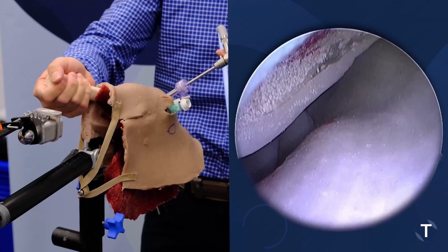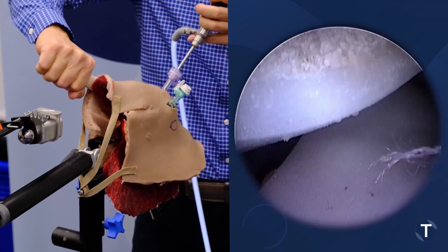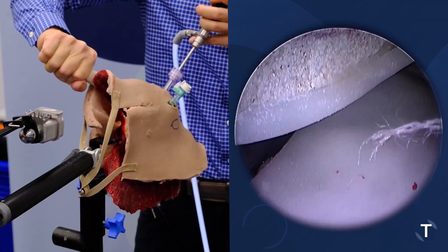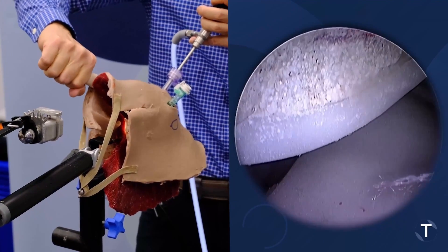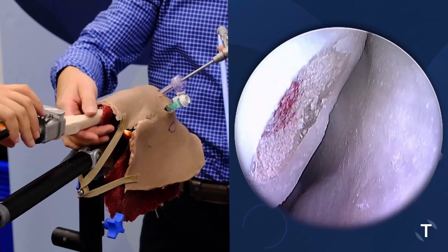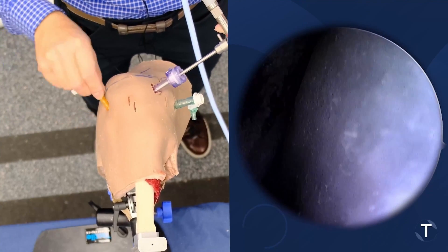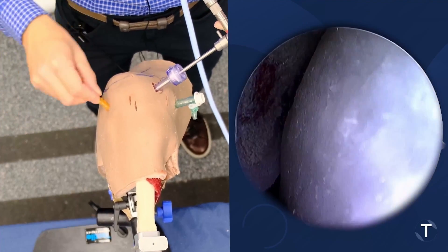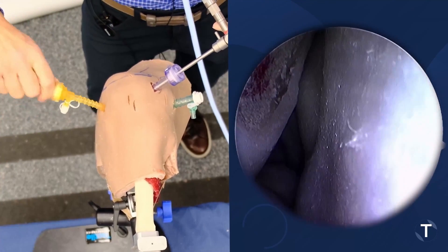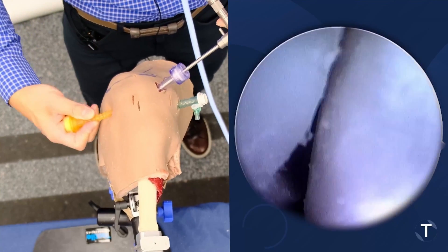We're going to bring the arm through a range of motion to see how the humerus engages into the leading edge of the glenoid. This one looks big to me. There's also some bone loss on the glenoid side, so I think we're going to do essentially a remplissage procedure here. You can see I'm rolling the cannula against the capsule and the tendon to make sure that it is staying extra-articular. You don't want to penetrate the capsule because you want to actually use the anchors to penetrate the capsule.